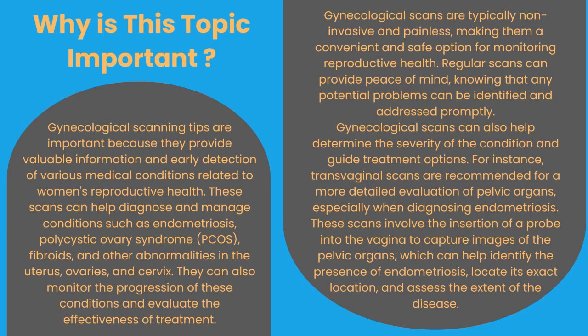For instance, transvaginal scans are recommended for a more detailed evaluation of the pelvic organs, especially when diagnosing endometriosis. These scans involve the insertion of a probe into the vagina to capture images of the pelvic organs, which can help identify the presence of endometriosis, locate its exact location, and assess the extent of the disease.